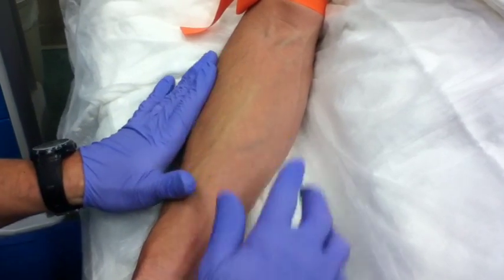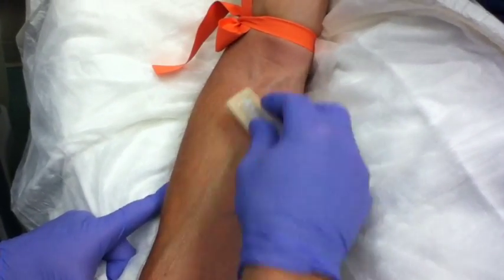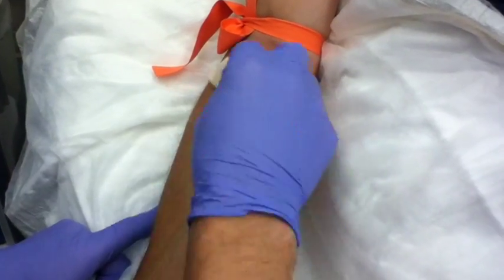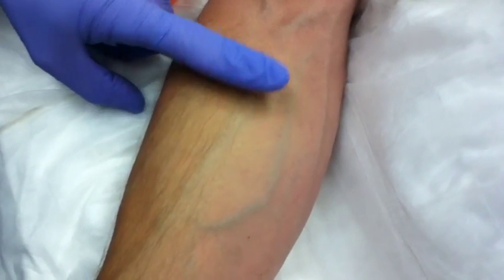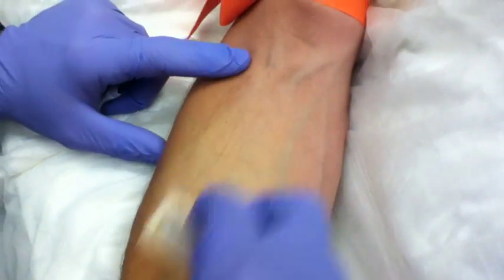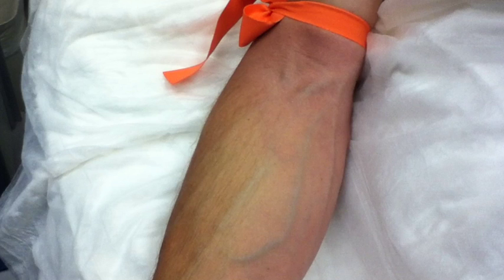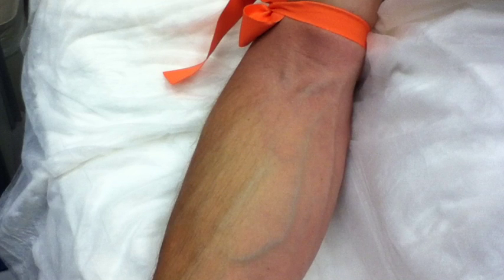For this particular patient, I'm going to use this vein right here — it's nice and straight with good puffiness. Cleaning it with alcohol allows it to kind of shine. We prep for 30 seconds of scrubbing and then about 15 seconds of dry time. Feeling all the way down, I can feel the vein on top, and putting a little proximal pressure shows it up even more. IV size is also a factor — if we need a CT scan, we'll want an 18. For this demonstration, we'll just do a 20. Since this is a thin arm, I can see the vein easily, so I won't need an aggressive angle — maybe a 10 to 15 degree angle.